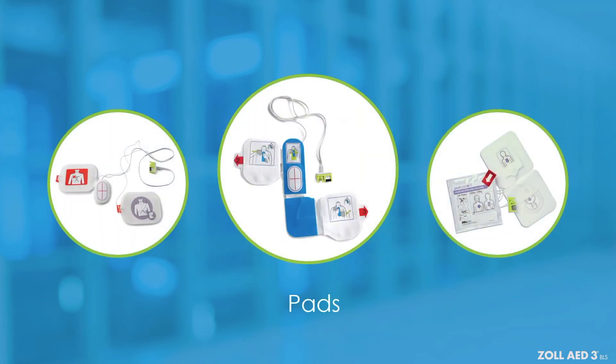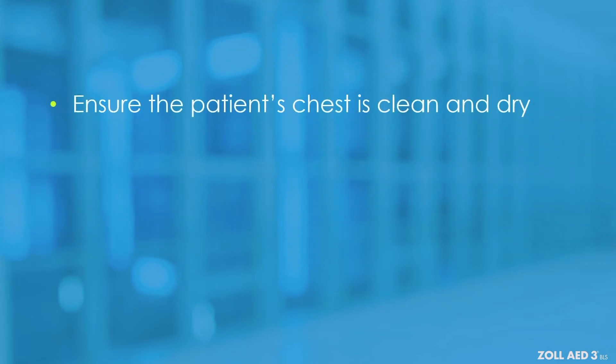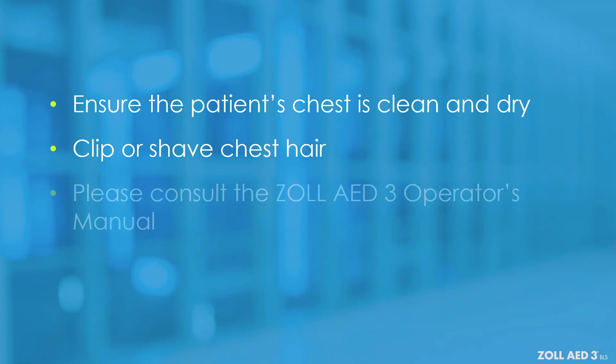Place the pads as previously described. Ensure that the patient's chest is clean and dry. If the patient has excessive chest hair, clip or shave the chest hair. If you have different pads, please consult the operator's manual for manufacturer recommendations.